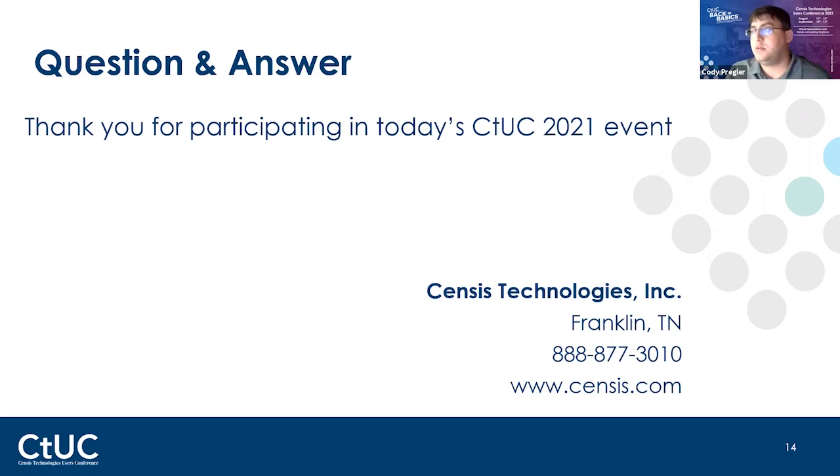One of the questions that we had here is, to make this process easier, do you need to have CensiTrac installed in the OR? And does the OR staff need to be trained on how to document that, or is that kind of a facility decision? So I would say that's a facility decision. Yes, you can put CensiTrac on the OR computers, and they just need a scanner, and then they could be documenting those IUSS loads.